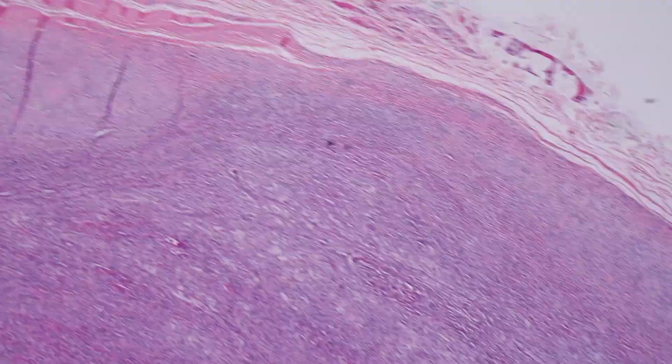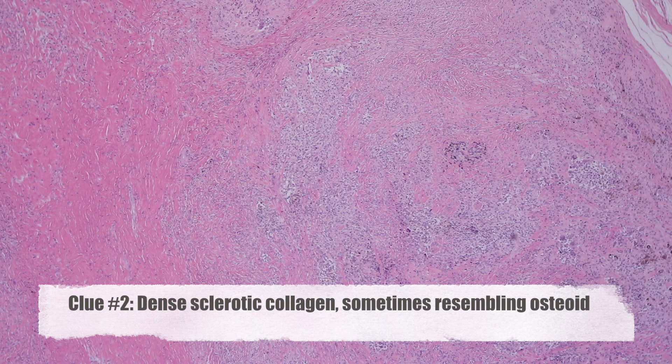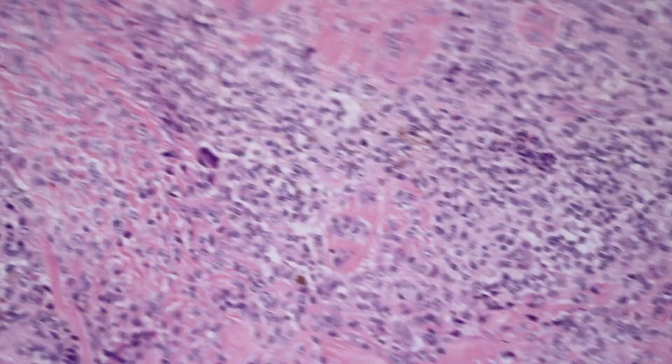You can see how beautifully circumscribed this particular example is, very smoothly circumscribed around the outside — that's a good feature for the localized form of tenosynovial giant cell tumor, giant cell tumor of tendon sheath. Another example shows a pale but very sclerotic background. One other finding in tenosynovial giant cell tumors is that the background collagen tends to be very dense and sclerotic, and sometimes it can even resemble osteoid. Finding the mononuclear cells embedded in this very sclerotic background is a really characteristic feature. Notice these mononuclear histiocytoid cells typically have open chromatin, punctate nucleoli, and abundant cytoplasm.